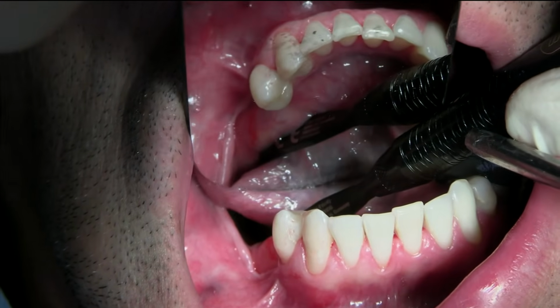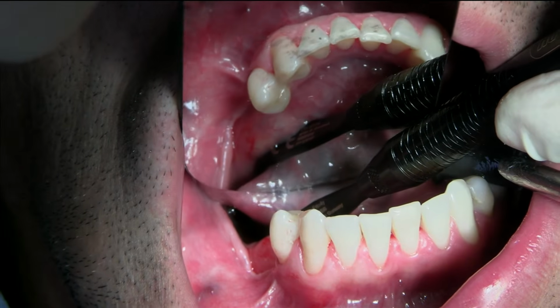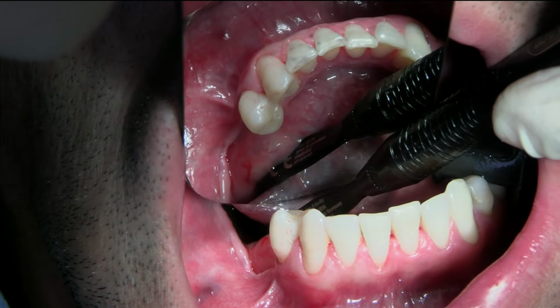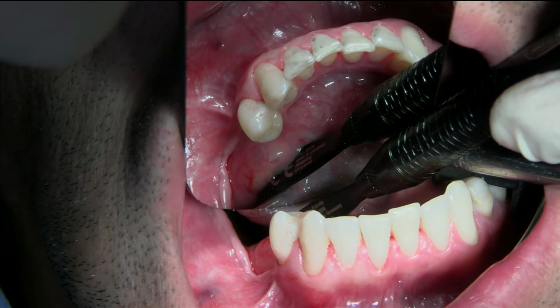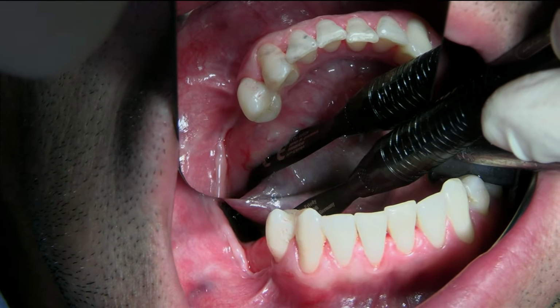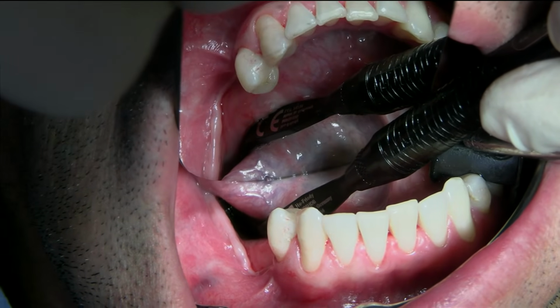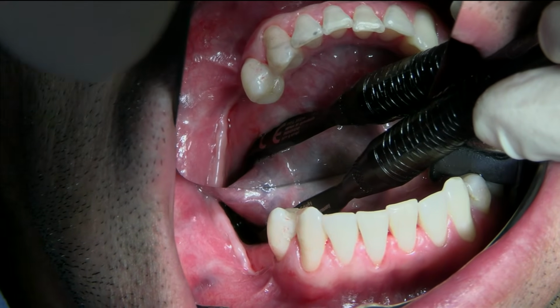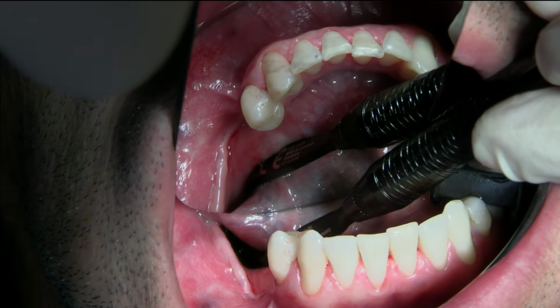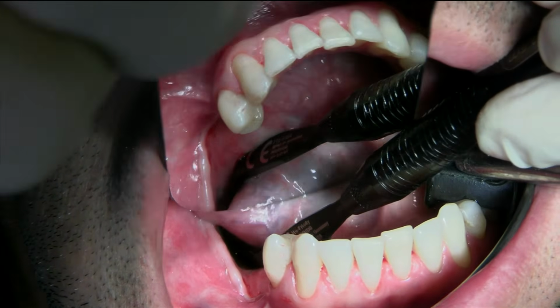So that's your vertical defect. What's worth noting here is obviously a really nice bone peak on the distal of the first premolar. Then it dips really deep. And in the posterior, also a good level bone platform. And then what's worth noting is that we have really a little band of keratinized gingiva, which I'm going to try to maintain on the buccal and lingual.